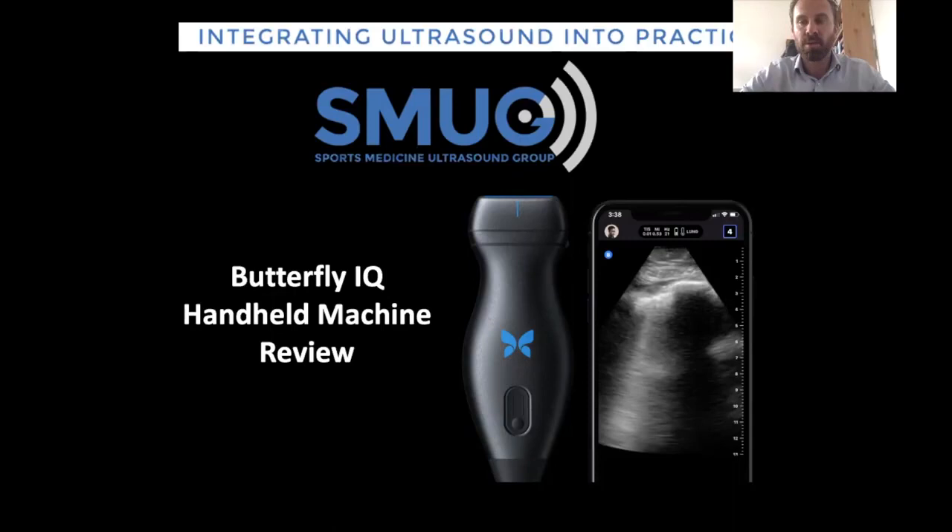Hi there, my name is Chris Myers. I'm one of the guys that runs the sports medicine ultrasound group here in the UK. During the lockdown, I've reviewed quite a few machines: the Alpinion, iCube 7, the Philips Lumify, which I've spent some time with over the last week and will be publishing my thoughts on. I've also had a closer look at the butterfly machine, and today we're going to focus on the butterfly IQ.